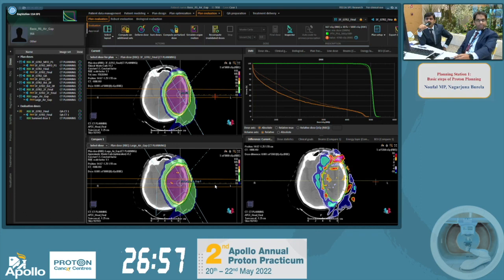Distal part of the beam will have uncertainty about penumbra as well as RBE, theoretically, which is discussed about protons. So by adding more number of beams, can we take care of that? Exactly. Correct. You understood it well. So that's what you should not put end range, and you use multiple beams in order to mitigate the uncertainties. That's the idea.